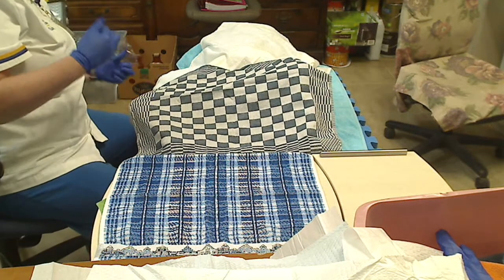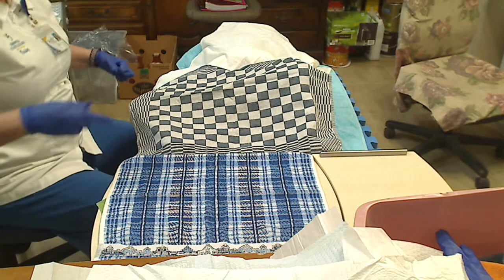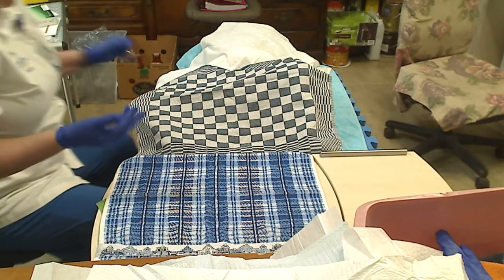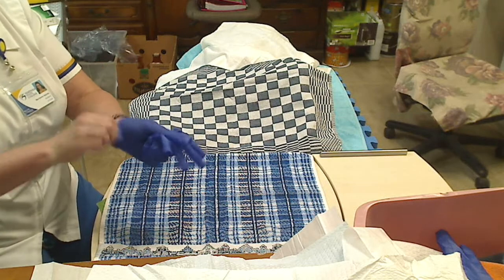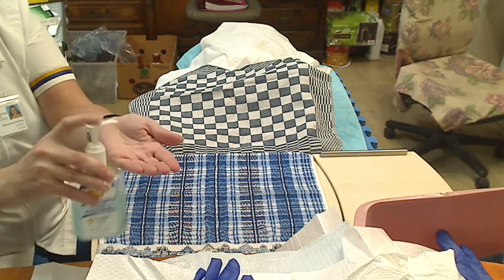Alrighty. I'm going to lower your bed back down again. I'm going to use my knuckle just in case. Alrighty. I'm going to go ahead now and remove my gloves. I'm going to throw these away because they're small. Hand sanitize.